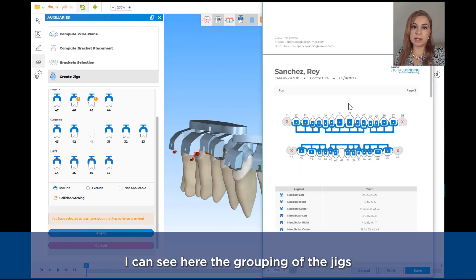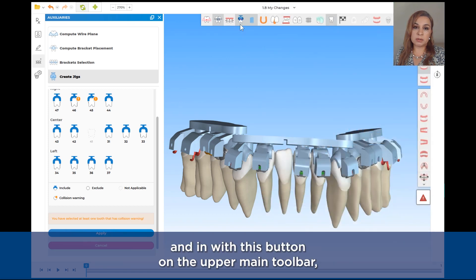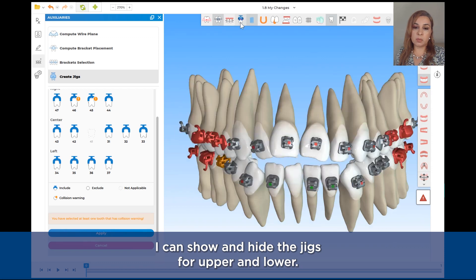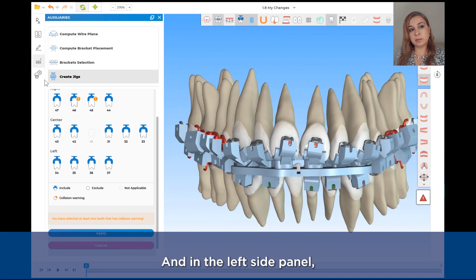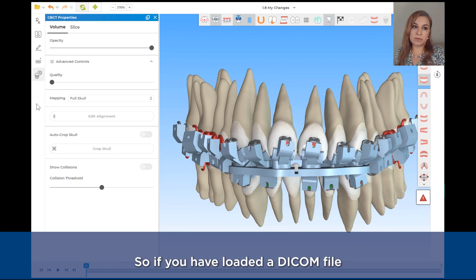I can see the jig groupings on the PDF report on the second page. With the button on the upper main toolbar, I can show and hide the jigs for the upper and lower arches. In this left side panel, the last button I have is the CBCT — so if you have loaded a DICOM file, it will be visible here.